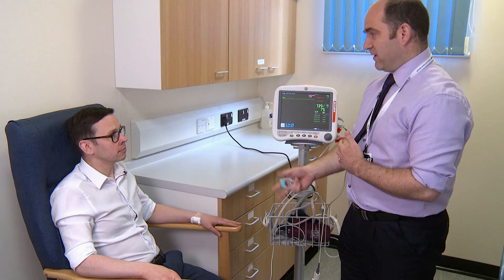So at the moment you're breathing 21% oxygen. When you go up into a plane, the oxygen levels can drop to as much as 15%. So we need to check whether you're going to be okay on the flight or whether you're going to need to take any oxygen with you.